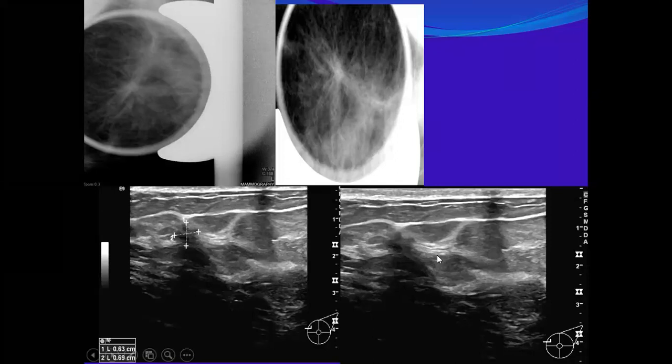Subhanallah. Yes. And there were no other changes. You see, look, it was maximum even 6 millimeter. It was a 6 millimeter invasive cancer. On mammography, it is suspicious as a mass on the spot magnification only, not on the standard view. Here, look at the center, Abir. Look at these spicules, and the center is dense. So this is a spiculated mass.